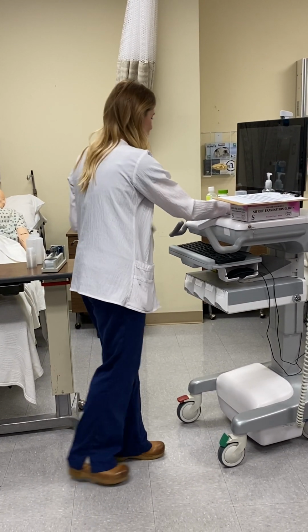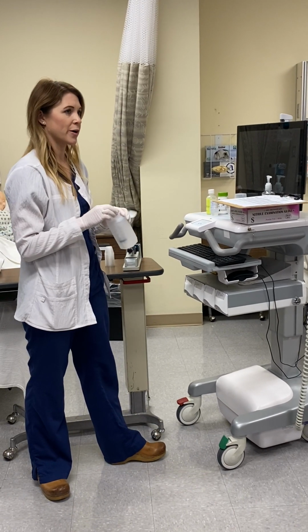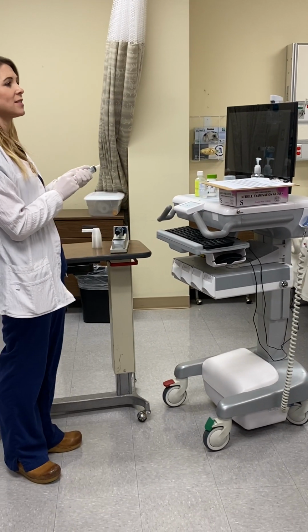Okay, so now this one actually, I need an assistant. I need some water. Give me some water, please. I would already have had this out of the sink in the classroom.